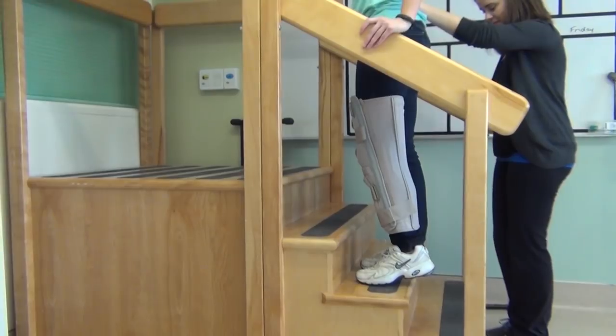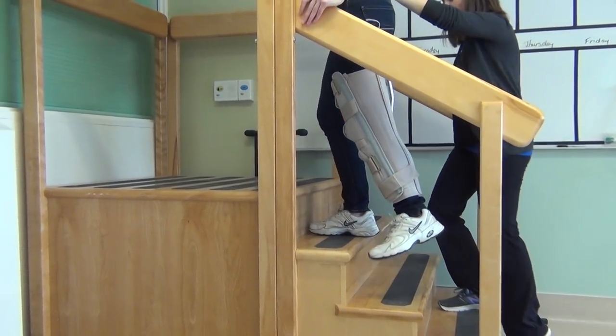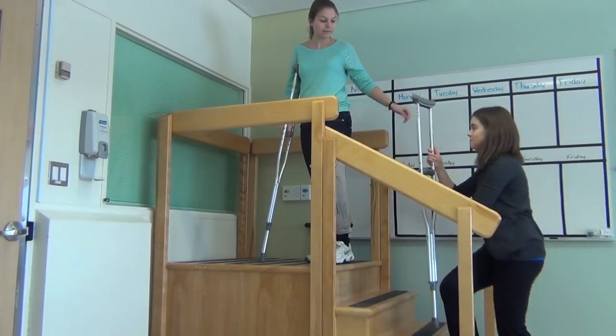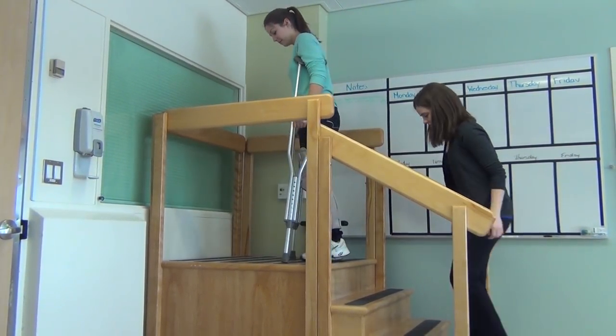When going up the stairs, start at the bottom stair. Push down hard on the handle of your crutch and railing. Lift your good leg onto the first stair, follow with your crutch and step up with your injured leg. Continue up all the stairs. Remember that when going up the stairs, the good foot goes first.